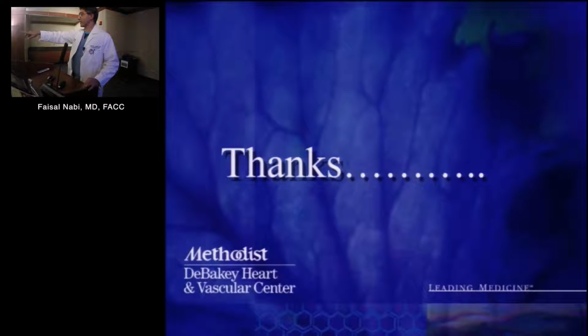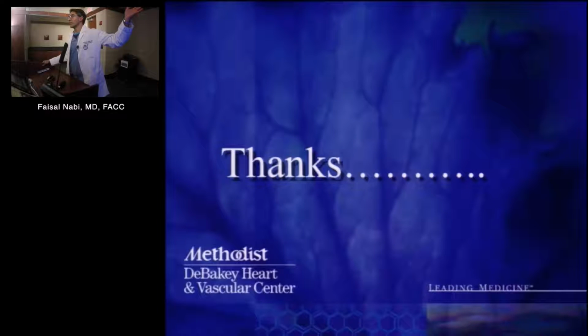That's where it becomes difficult, Dr. Z, because if you have associated fluid, it will have a very similar Hounsfield unit to your pericardium. So a lot of times I'll see something and I won't know if it is thickened pericardium or fluid. And that has happened many times. And oftentimes they have fluid. That's my point. Yes. And so, because you don't want to get a false positive, saying oh yes, I see it's 4 or 5 millimeters thick. It could be fluid or it could be bigger.